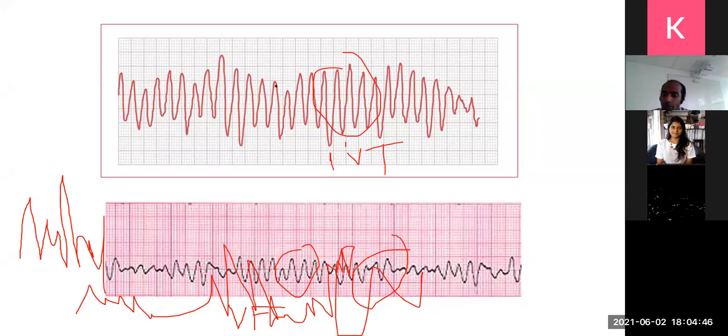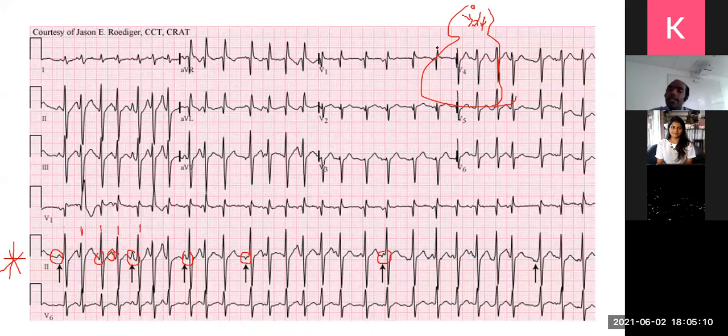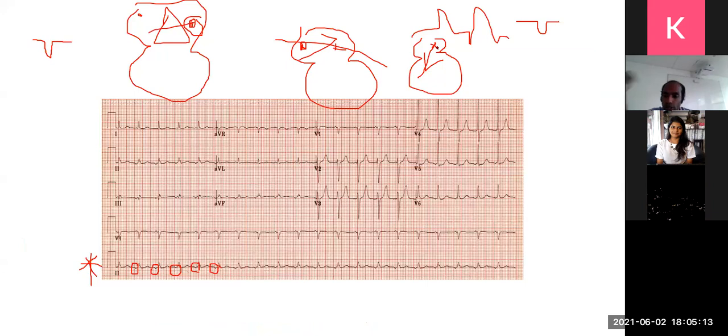Okay, another good question from Shalit. Does the SA node work in atrial tachycardia? Not usually, it is suppressed, Shalit. So therefore, the only thing running the show is this abnormal atrial focus. And usually, yes, unifocal atrial tachycardia starts from the left side. That is where the problem is, most commonly. So the P wave is usually negative. Normally it is positive in this way, now it's going the other way. So the P wave is usually negative.